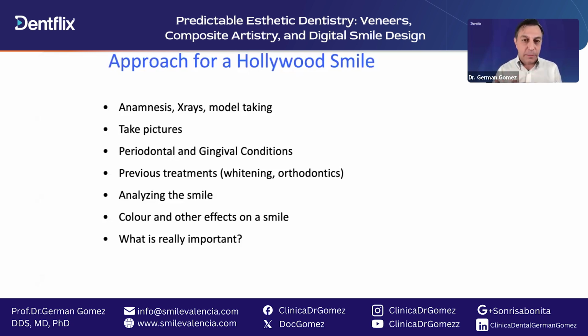We have to give him all the information that he has to translate into the 3D model. So we decide what to do. We are the architect of that digital smile, and he designs it on the 3D model. And then we check and counter-check and we have to refine everything that he does. And at the end, when we say, now it's good, then he goes and makes it.